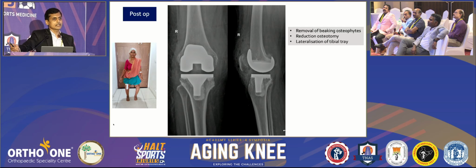Just yes. The kinematics can be seen in 45 degrees and 90 degrees also. The X-ray shows a stress view taken at full extension. If you take it at 45 degrees, 90 degrees, the laxity on the medial and lateral sides in flexion will also be visible. Yep, that's a good point. Yes, okay. We did it, as it gives a lot of information. Exactly, nothing more is needed.